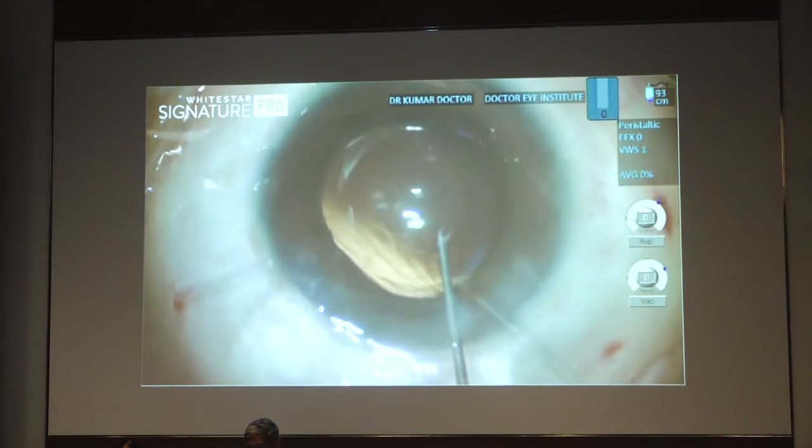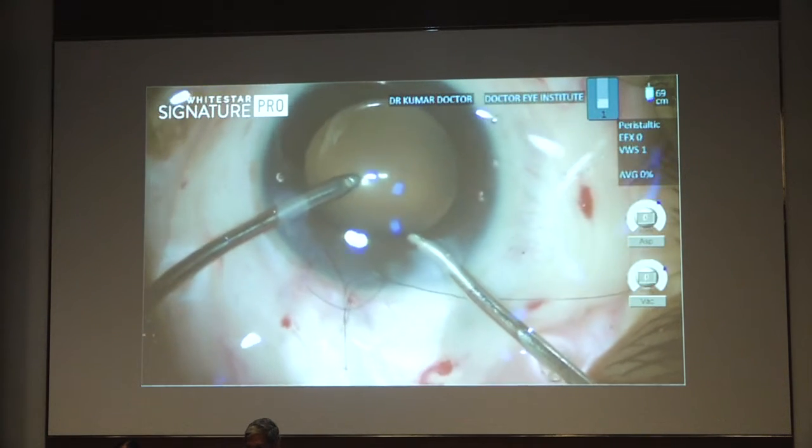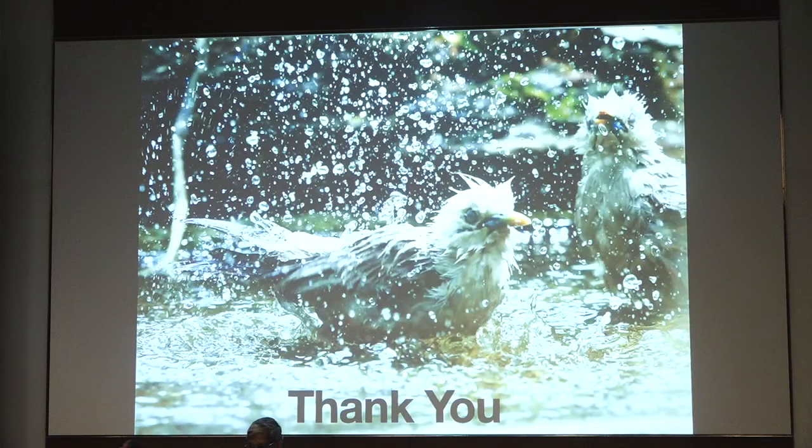Suture placed, bimanual IA done for OVD removal. Air placed. Post-operatively, overwhelmed to see the first day post-operative visual acuity of 20/60 and a refractive error of -1.5 spherical with a -1.75 cylinder at 20.